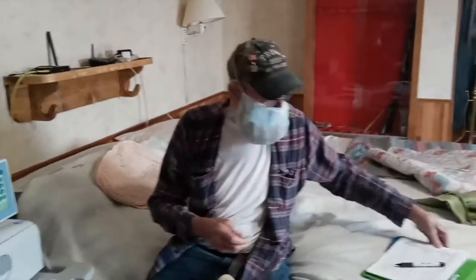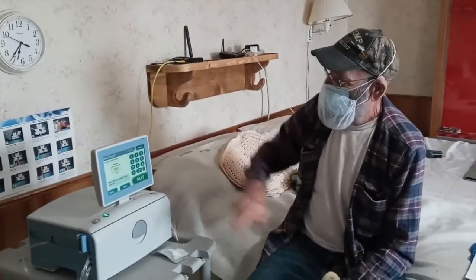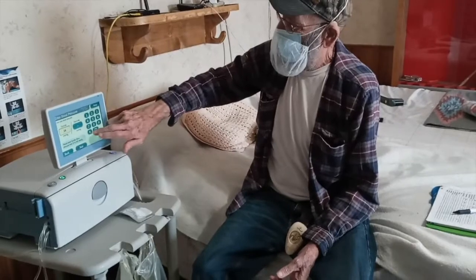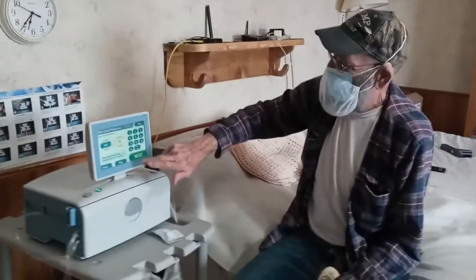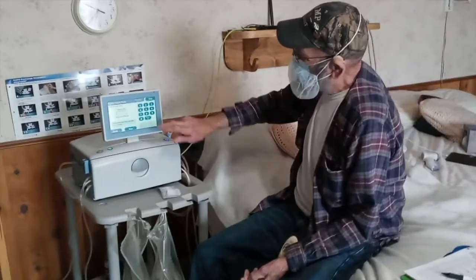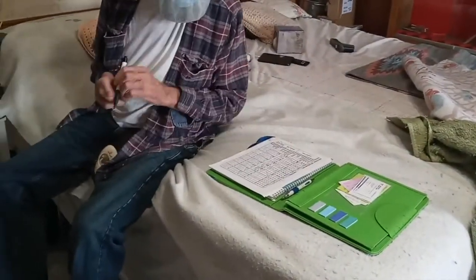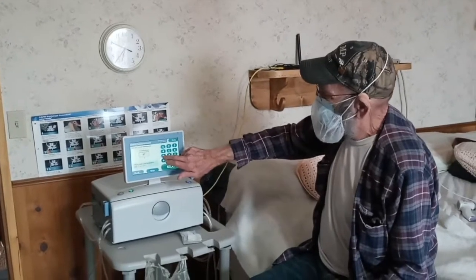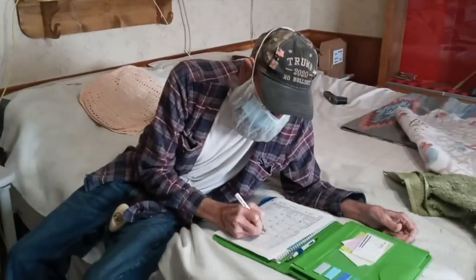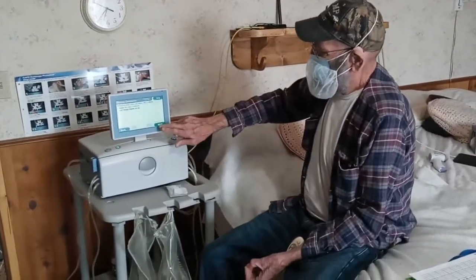Enter your current weight. Enter your blood pressure. Enter your heart rate. Enter your temperature. Deviations occurred. Contact your dialysis clinic or clinician.